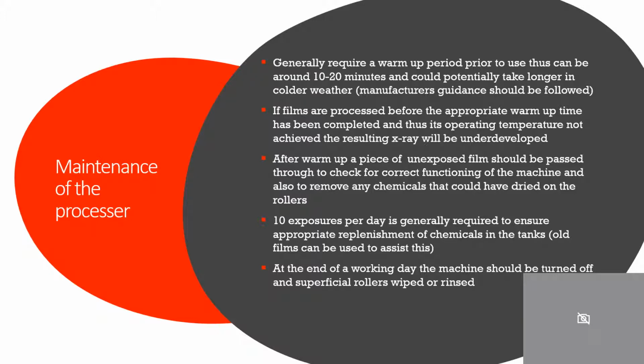Maintenance of the X-ray processor. They generally require a warm-up period prior to use, and this can generally be around 10 to 20 minutes and could potentially take longer in colder weather. Manufacturer's guidance should be followed. If films are processed before the appropriate warm-up time has been completed and thus its operating temperature is not achieved, the resulting X-ray will be underdeveloped.